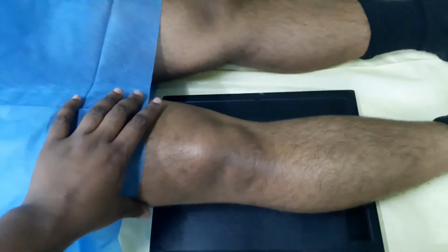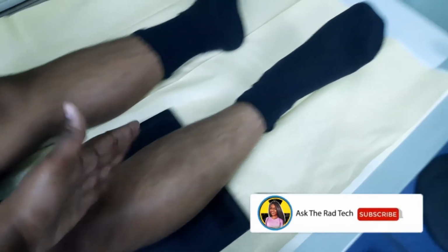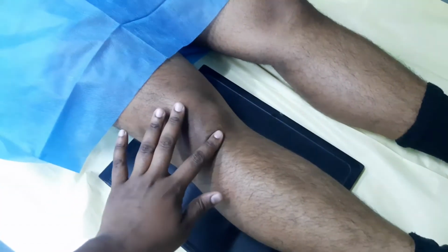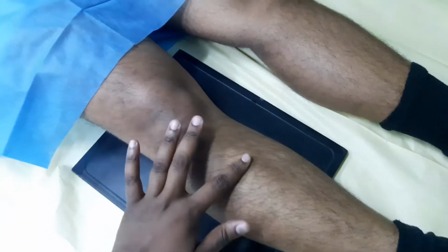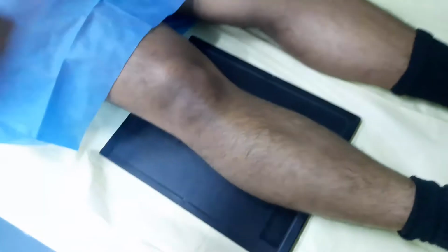So for the centering for the AP, first of all, you want to make sure that the patient's leg is straight. So right now his leg is rotated outwards, as you can see, based on how the toe is pointing. You want to straighten the knee to make sure that it's pointing, now you can see it pointing upwards, right? And what you could also do, if you're not sure, is palpate and feel this area here, the tibial tuberosity, the little bony projection. You could feel that up here, and once it's running in a straight line, you know that the leg is straight. That's an extra tip there.